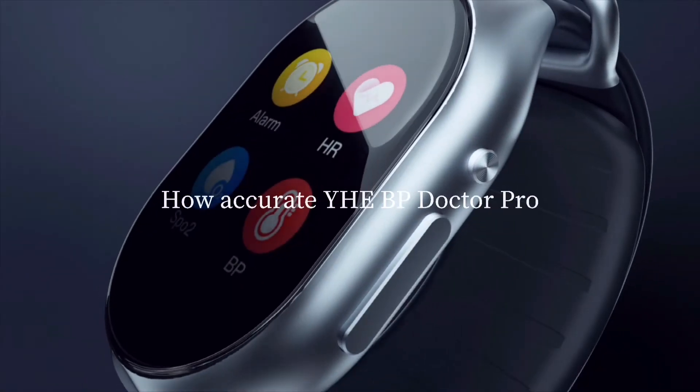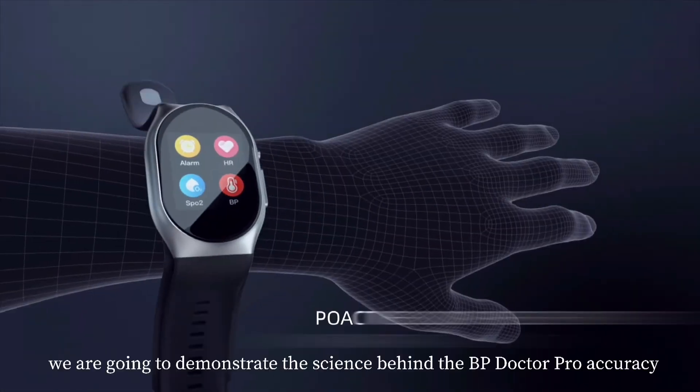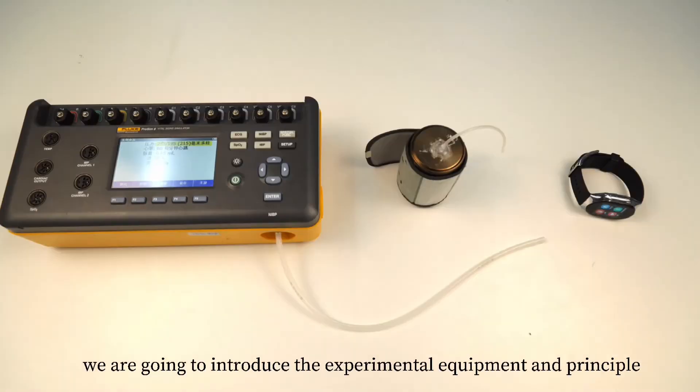How accurate is YH-BP Doctor Pro for blood pressure measurement? In this video, we are going to demonstrate the science behind the BP Doctor Pro's accuracy. Before we start, we are going to introduce the experimental equipment and principle.